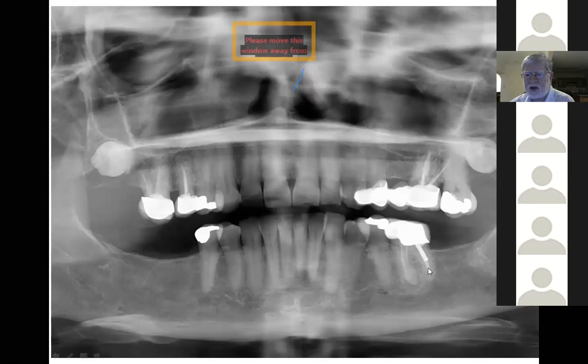Very often in a situation, if we leave aside the bridge, I will come across, and you will come across, so many situations of a patient where you pick this up as an incidental finding, they're getting no symptoms whatsoever. It's your duty to explain to them what's going on. Maybe you don't want it to be there. What are the different options? And you'll say to them, well, would you lose the tooth and have an implant there?